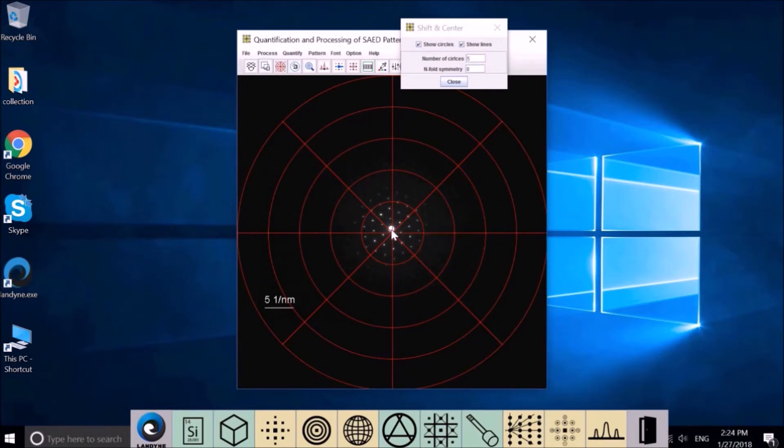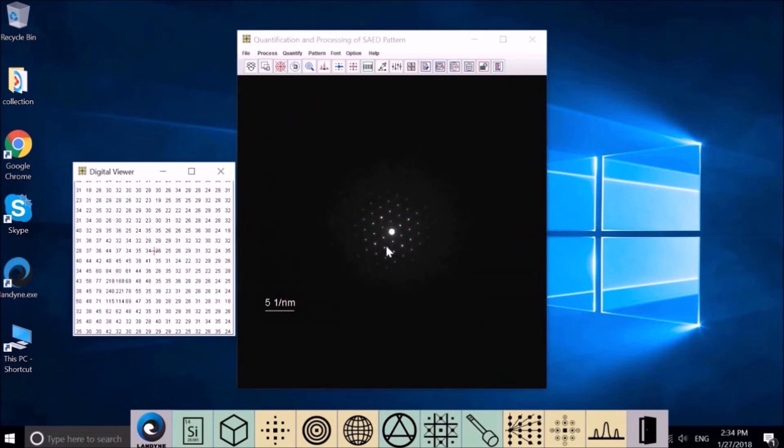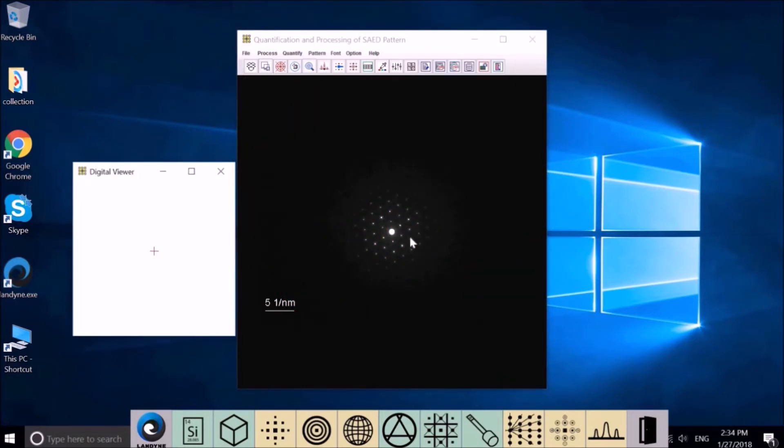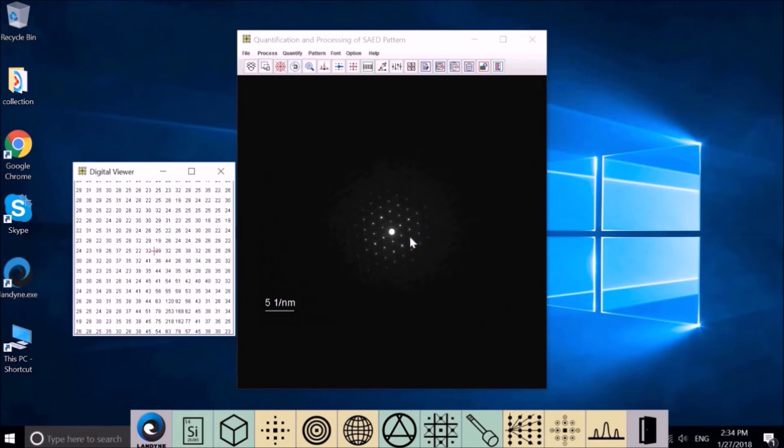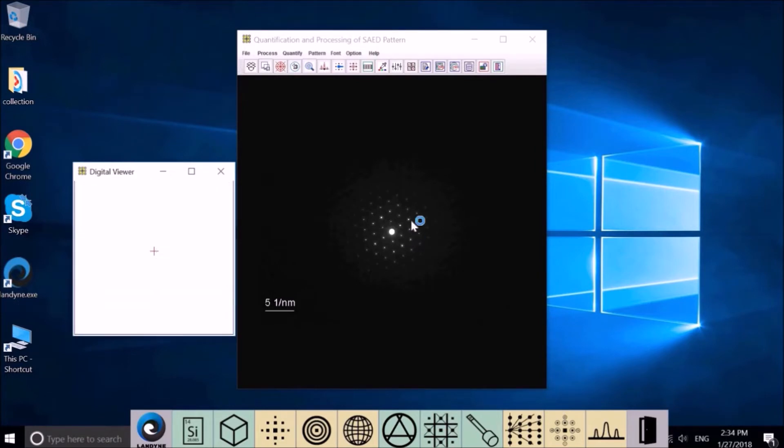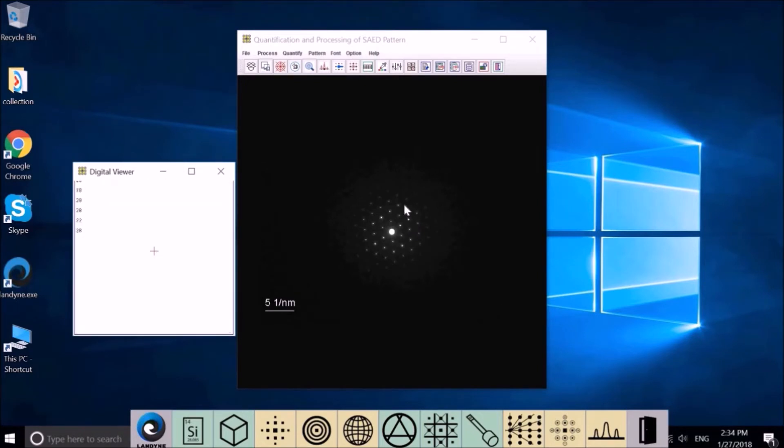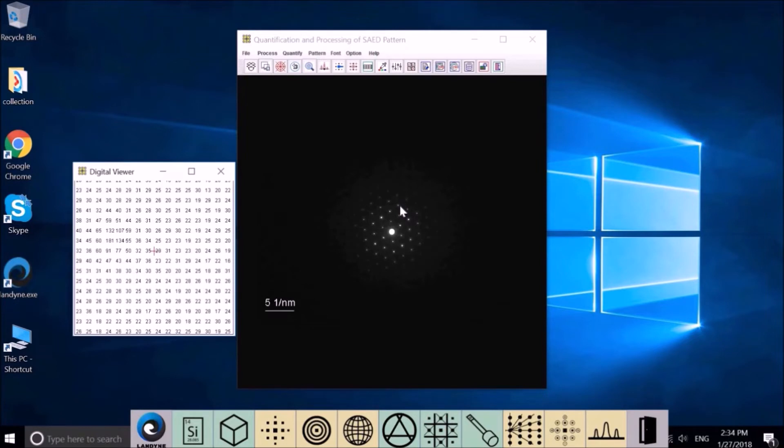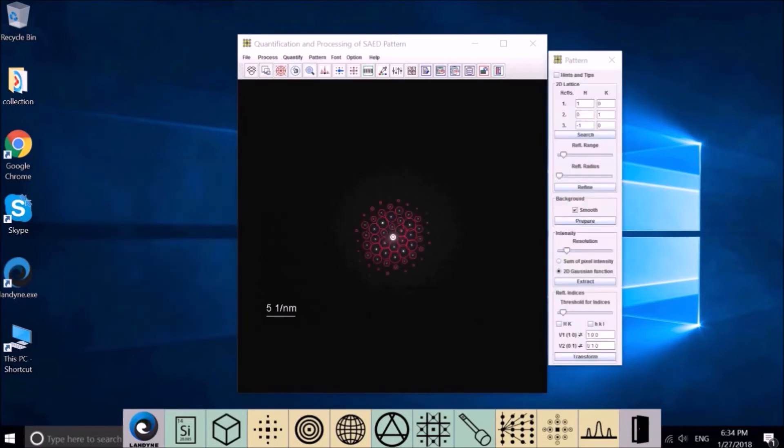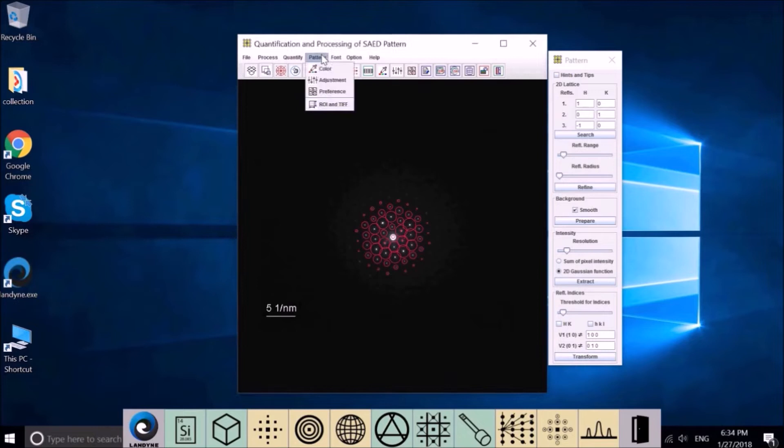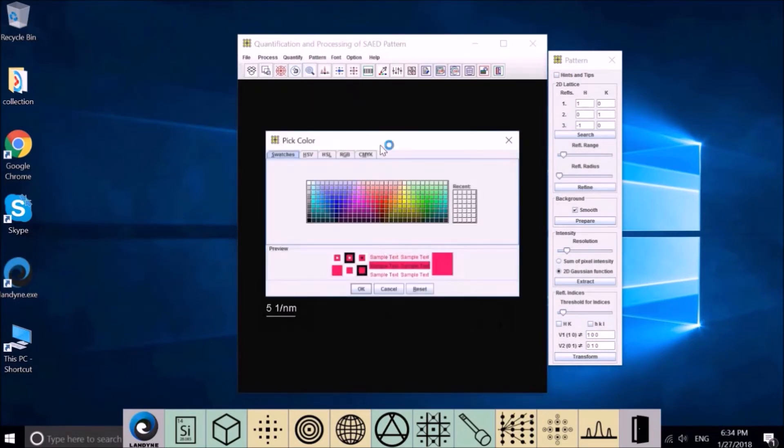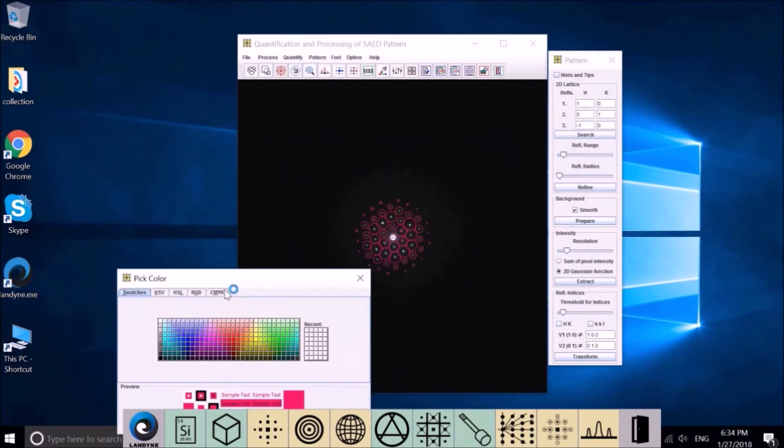The main application is to measure the intensity and basic diffraction vector. This is the magnifier. Move your mouse to anywhere, it shows the local digital information. In this way, you can tell which diffraction spot is saturated or not, and also help you to find the true spot location.